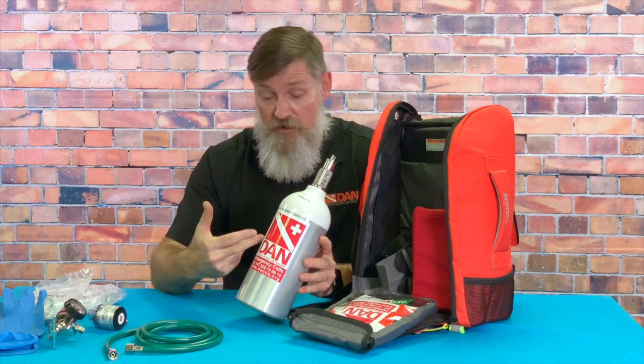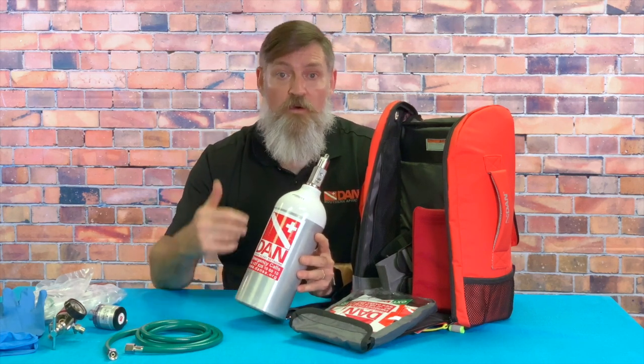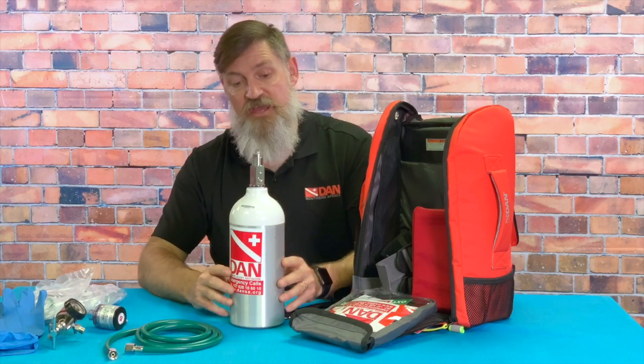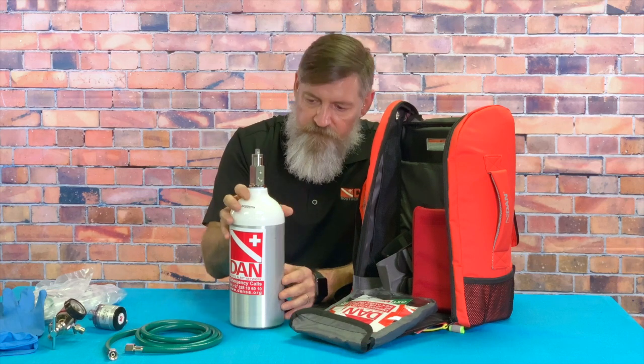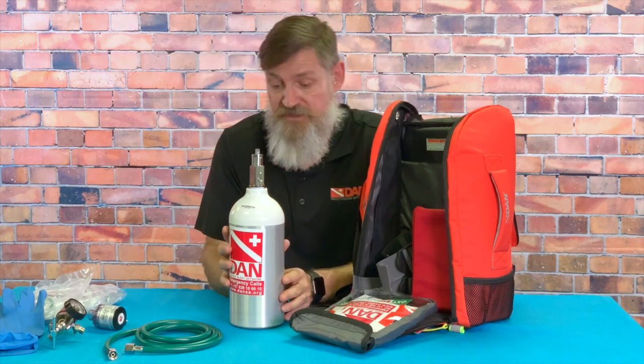This cylinder, depending on how many people you have on the unit or what flow rate you're using, gives you around 14 to 20 minutes maximum. So again, not ideal for long boat rides — something best used poolside, waterside, or any place not too far from advanced emergency care.